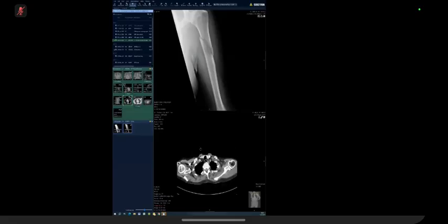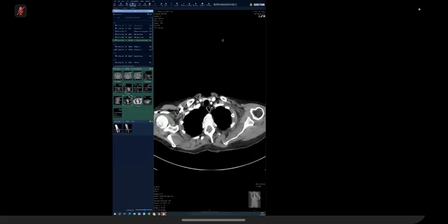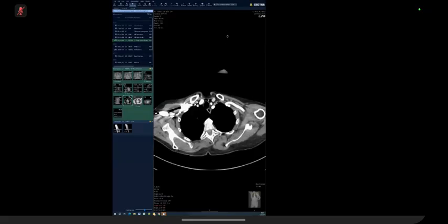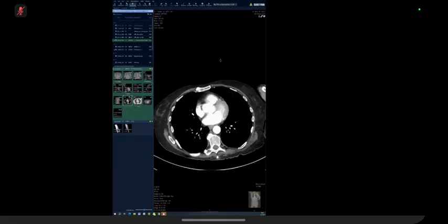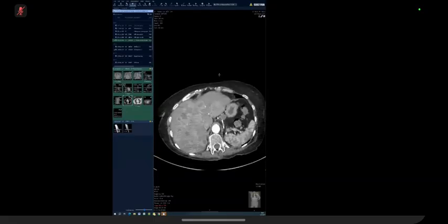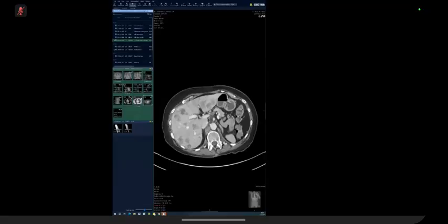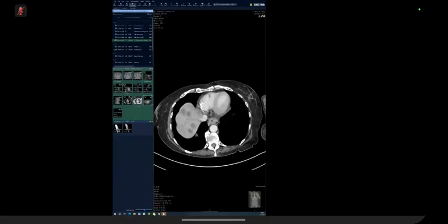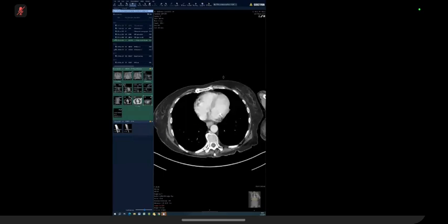So once you've done the CT, you have to go through the CT in a systemic way, and you have to say it out loud. You're going through, I'm looking for a primary. The lungs appear clear. Don't be enticed by the clear abnormality you see straight away, because there are so many liver lesions, you want to start talking about them straight away. But because you see the liver lesions, you should think, okay, so it is cancer. I was right. Don't focus on the liver lesions.